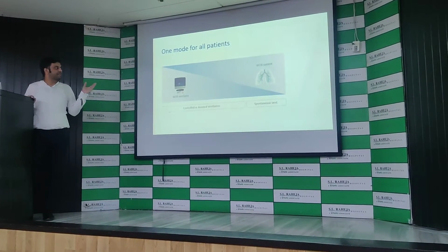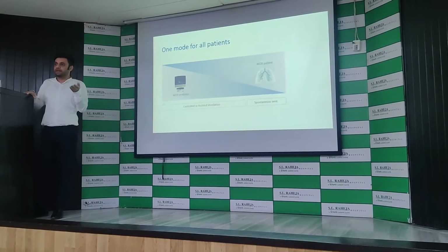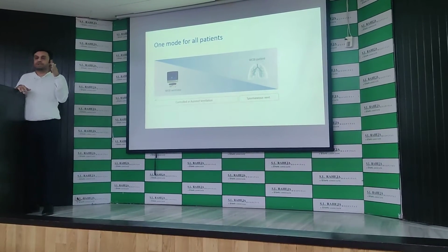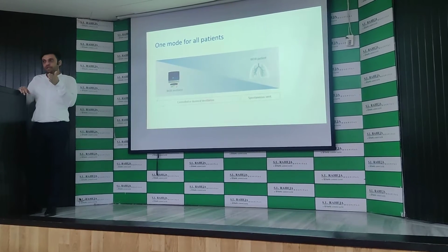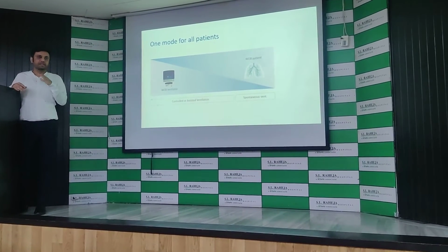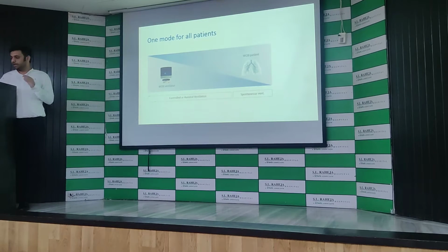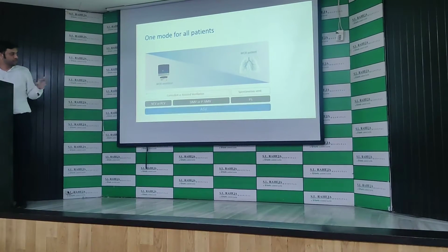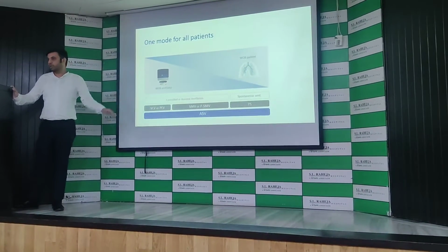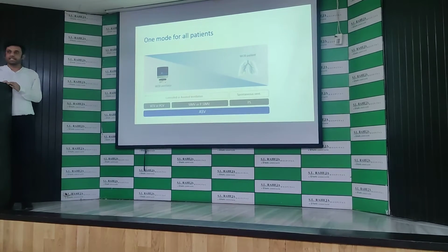So as I said, when we talk about ASV, for a passive patient it is a volume targeted pressure control, but for an active patient it is a volume targeted pressure support. So this is how it exactly works in ASV for all the patients, whether in control, assisted or spontaneous ventilation. So this is how they have mentioned that VCV or PCV or SIMV or PSIMV or support, all exactly combine and work as ASV.